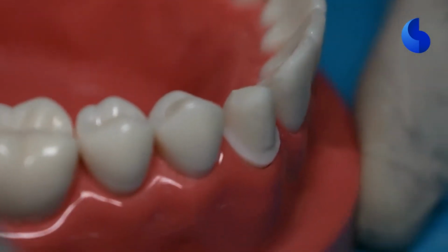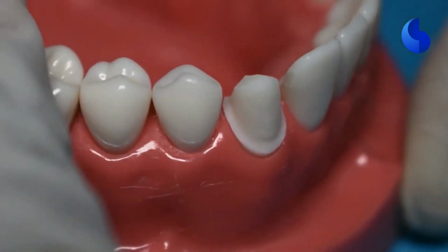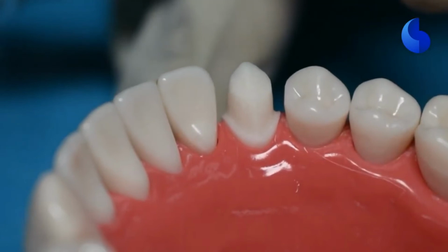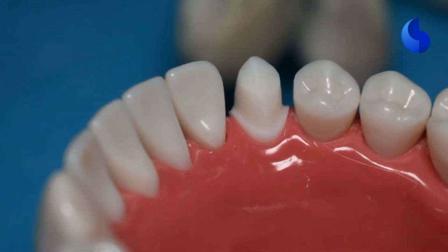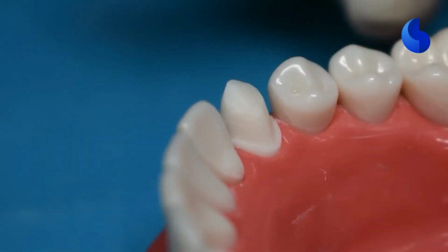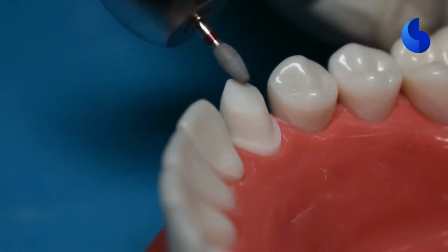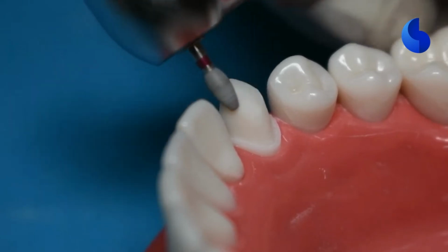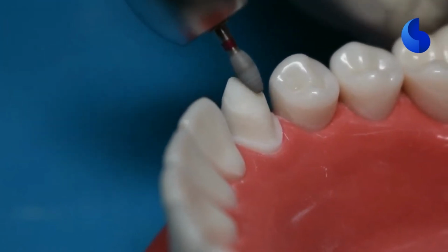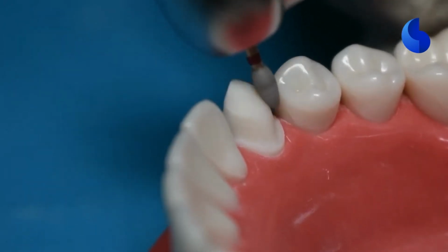After all our refinements, take a look at your preparation to make sure that you have an even width of 1 millimeter all across. And once you have that, you can go ahead and refine your lingual surface, because like I said, there's a ridge that runs on the lingual surface, and there are two fossas, the canine fossas, on either side of it. So to bring that into your preparation, you can use a football diamond and use that to reduce the surfaces on either side of your lingual ridge.